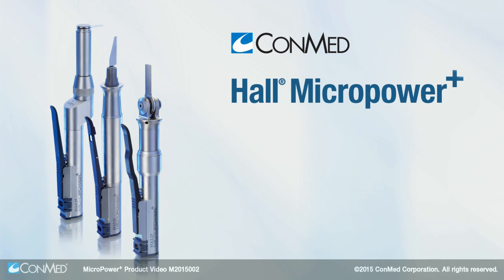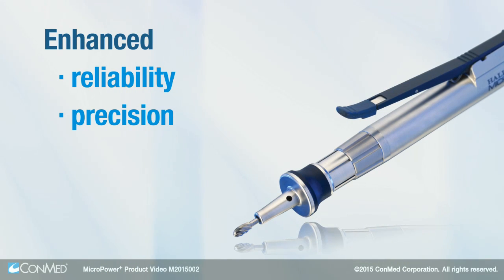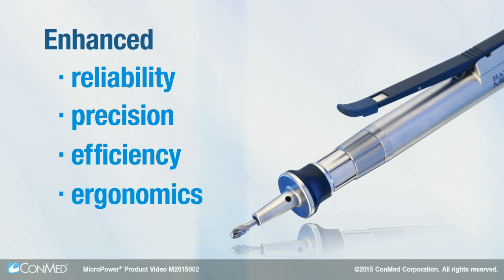CONMED's HAL Micropower Plus line combines the quality and power of previous small bone instrumentation with enhanced reliability, precision, efficiency, and ergonomics.